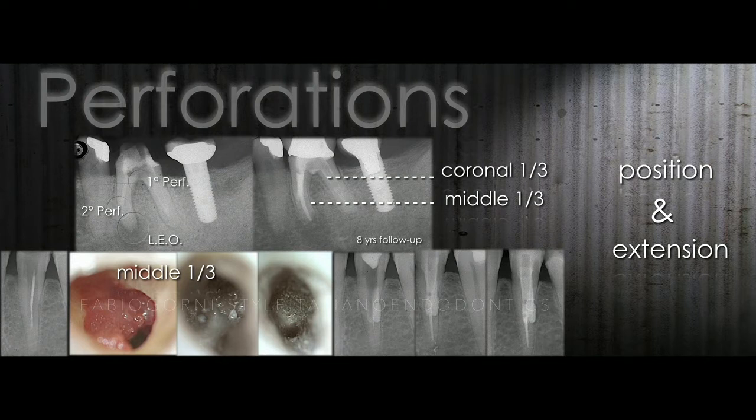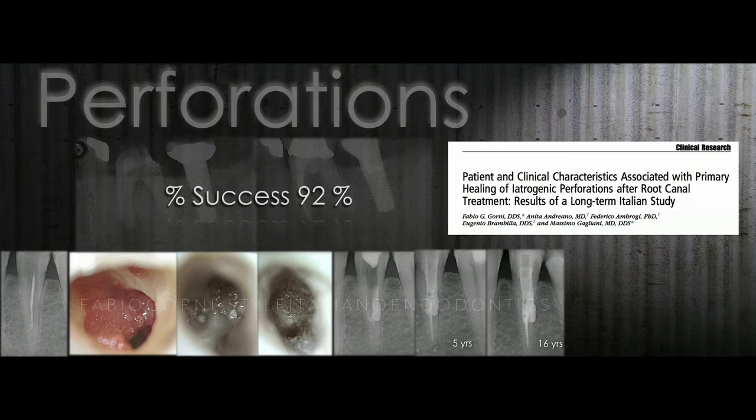And you can imagine that the devices that we use to reach the perforation, to clean it and to repair it are really important. Recently, our group published a clinical research about the follow-up on perforations, and the success rate was really great, more than 90%. And if you follow the healing of the lower premolar, you can see all the history of this case and the incredible situation after 16 years.